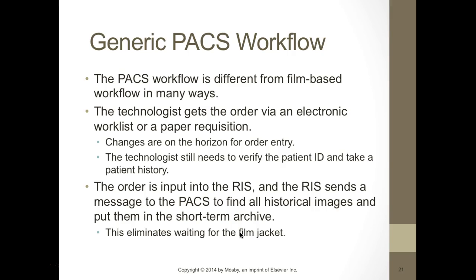It's almost instantaneous, which is great. So we get the order via electronic work list. We still verify the patient. The order is input into the RIS, and the RIS sends a message to the PACS to find all the historical data on that patient.